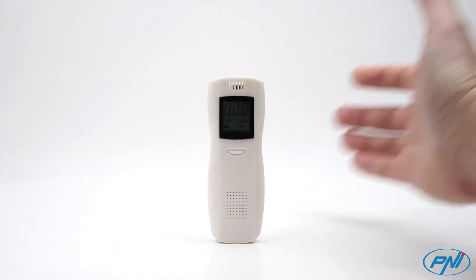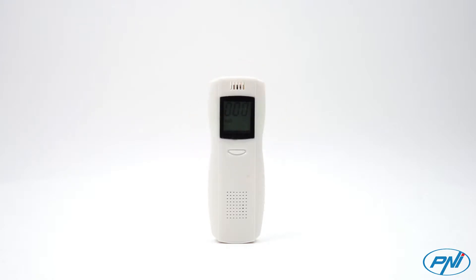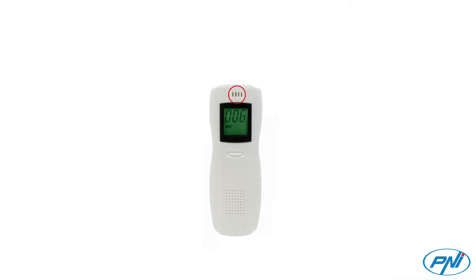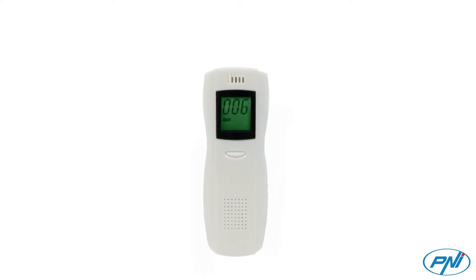It is equipped with an electrochemical sensor that measures alcohol concentration in the human body by analyzing the exhaled air. The person in question blows into the gas entry and the alcohol concentration is shown on the display, the reading time being less than 8 seconds.